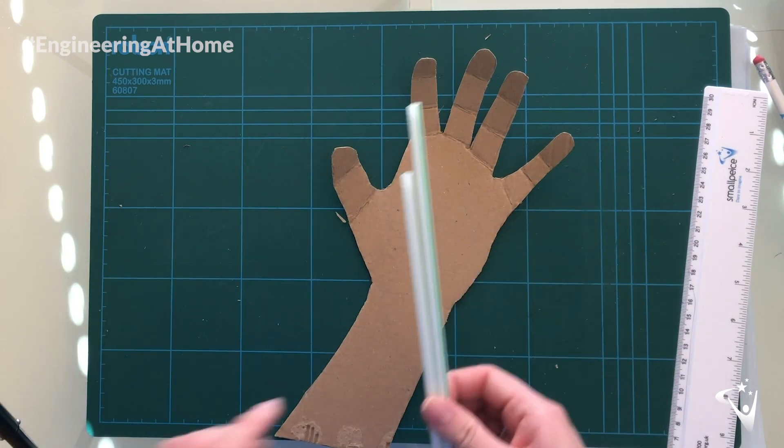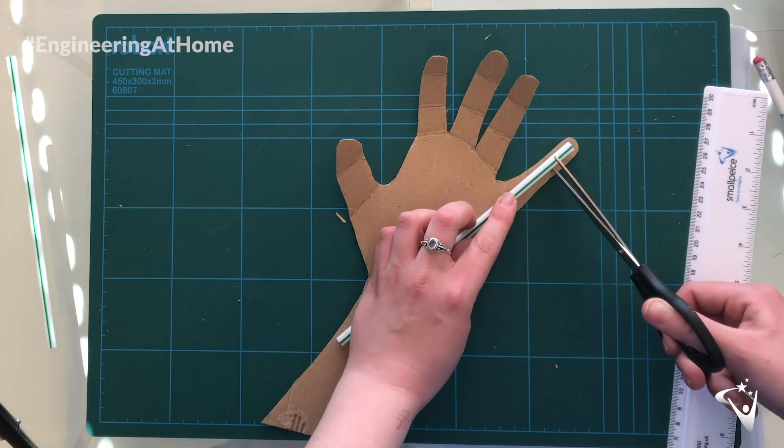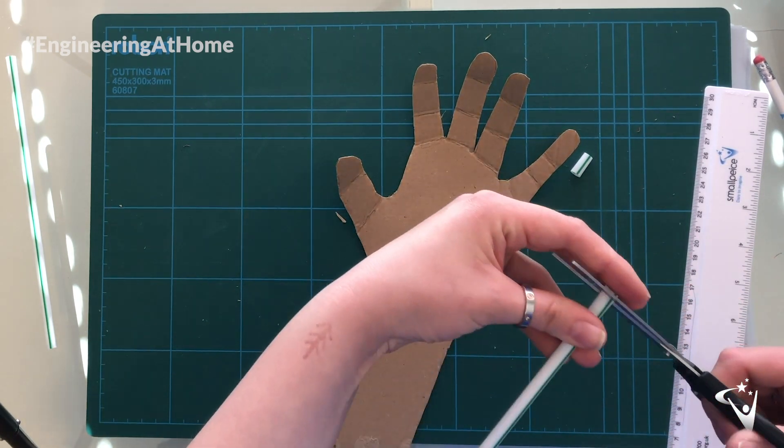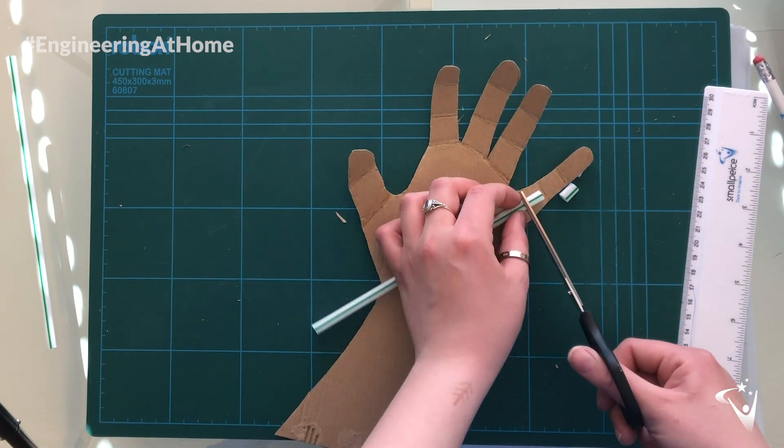You might find it helpful to give each finger a different color so you can tell which parts are for which finger. Next, we need to cut some straw to the length of each section of your fingers. Make sure you cut these pieces of straw slightly shorter than you think they need to be, so there's plenty of space for the fingers to bend.